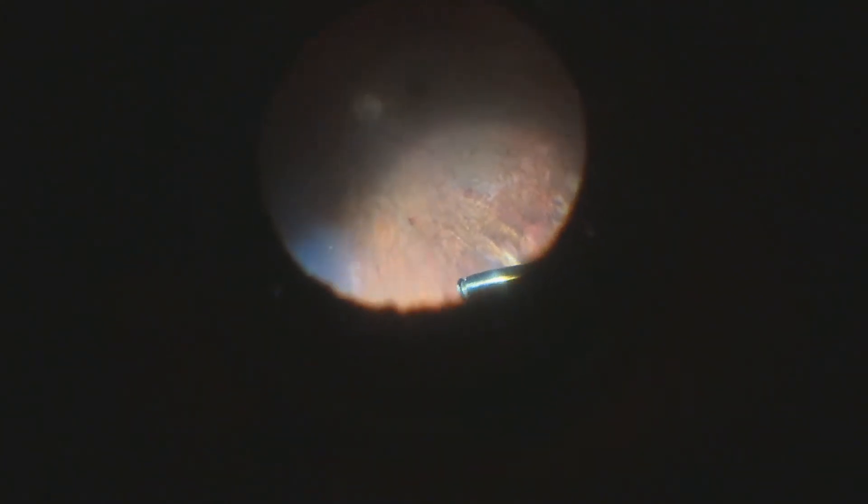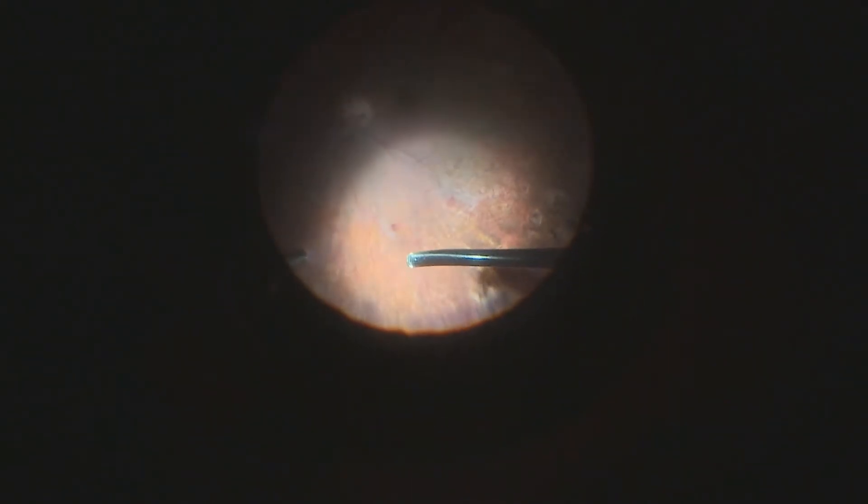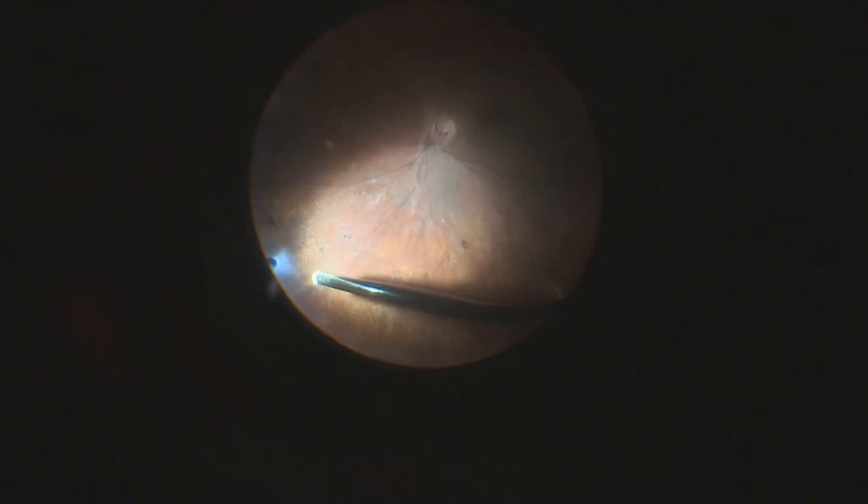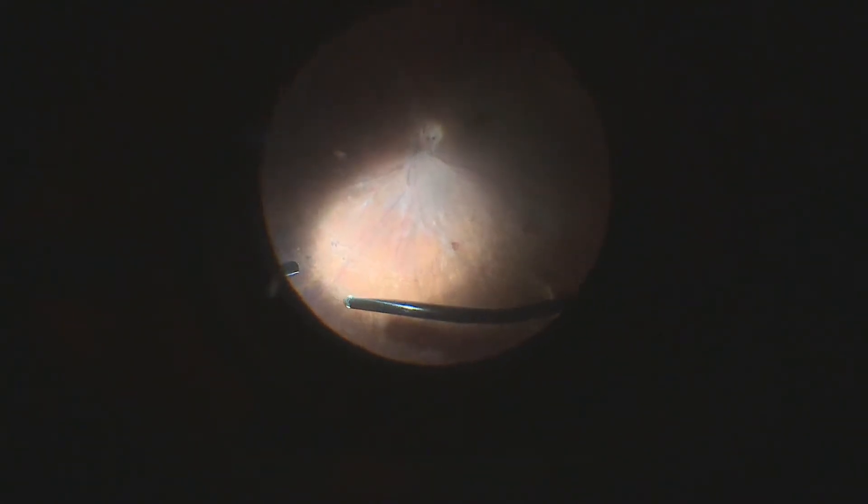Respecting the equator and the posterior pole. We rather treat the equator and the posterior pole with the removal of the posterior hyaloid, and when needed, medications to control the macular edema, either with corticosteroids or VEGF inhibitors. And when extremely needed, we do perform some soft and very light focal laser treatment for micro-edema on leaking microaneurysms — but very light and very soft laser.